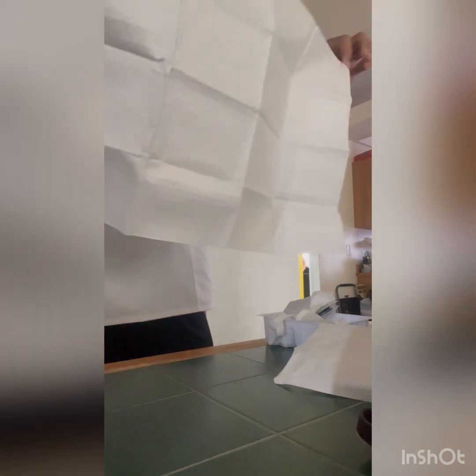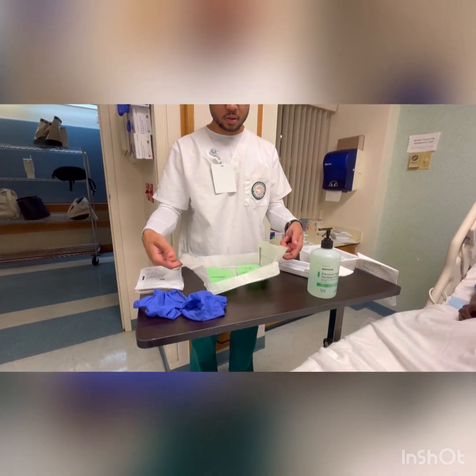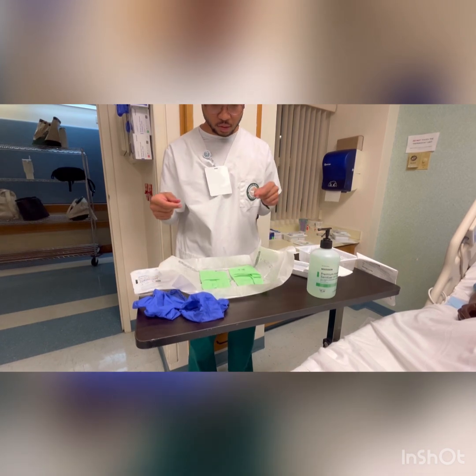Next, we would open the suction catheter kit or the gathered supplies if a kit is not available. And then we would place out our sterile field onto our area. We would then don sterile gloves, considering the dominant hand sterile and the non-dominant hand non-sterile.